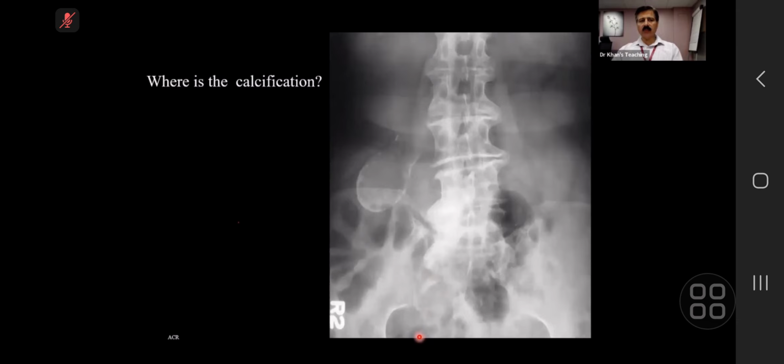Okay, that's fine. And even if you see on the CT scan, you will see the same thing. You might see a tumor, might not see a tumor. Even if you don't see a tumor, what are you going to advise? So this has to be removed there and then. So cholecystectomy, you have to advise a cholecystectomy. If you see latest literature, the original literature was quite emphatic about development of carcinomas.